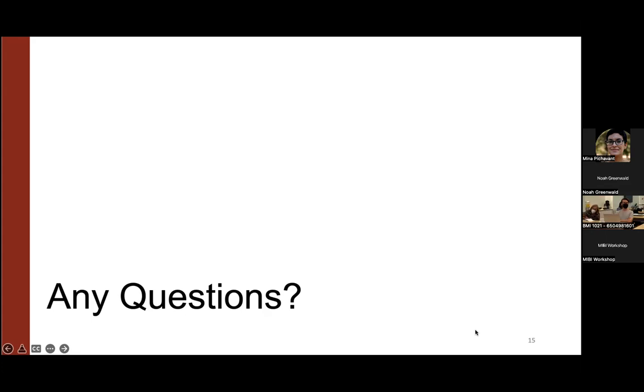Okay, we've got a lot more here, just waiting in case anyone in the room has some questions. Any suggestions for in silico validation if selecting targets from single cell RNA-seq data? From what we've seen, sometimes RNA sequencing and protein level do not match.